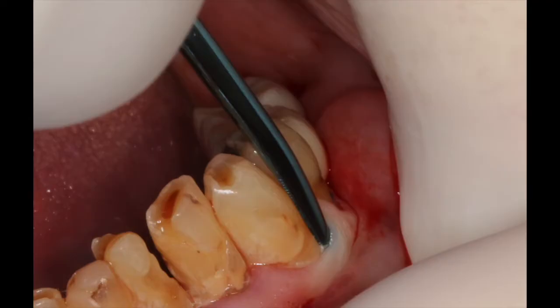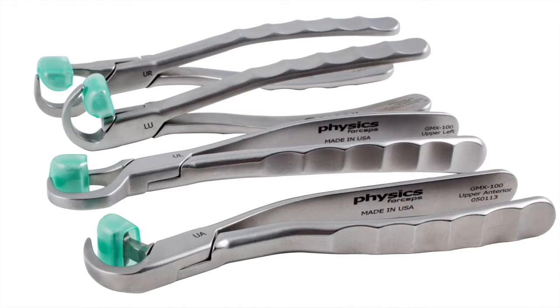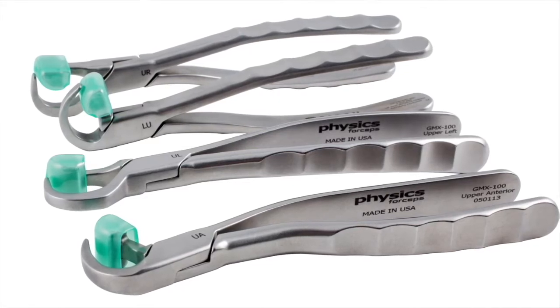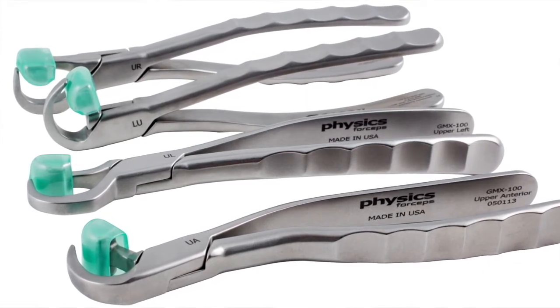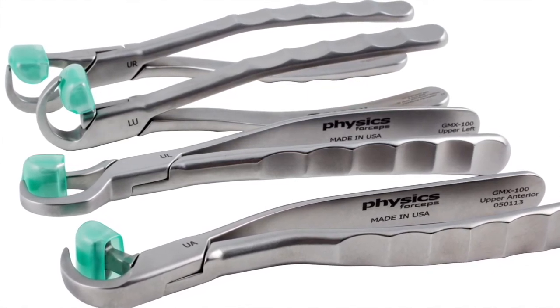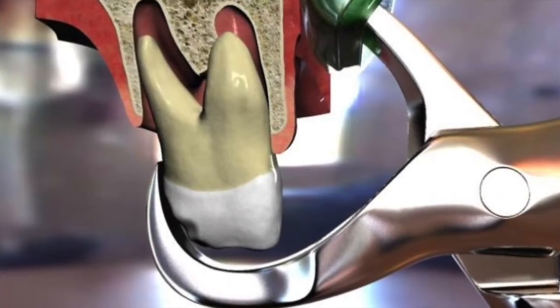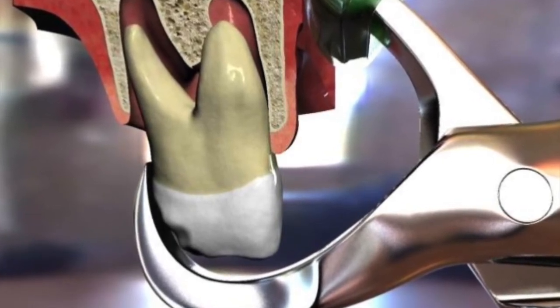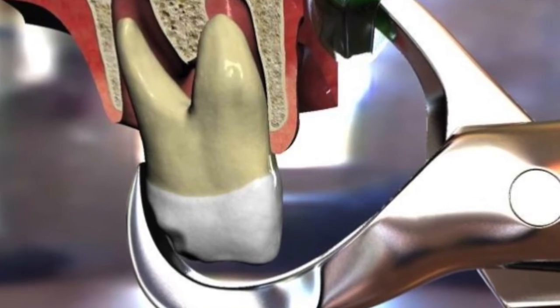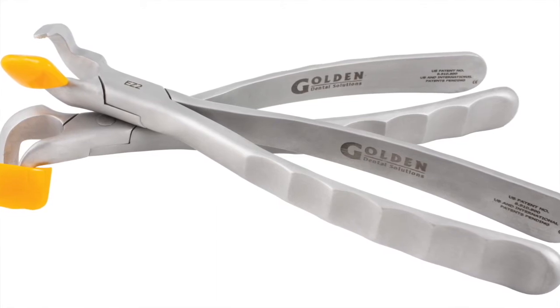Here we're taking a separator, placing it between the facial plate of bone and the root structure to loosen the tooth a little bit. We're then going to use the Golden Dent Physics forceps, which consist of four instruments: an upper left, an upper right, an upper anterior, and a lower universal. It consists of two components — a beak, which is placed subgingival one to three millimeters on the palate or lingual surface, and the bumper, which is simply a center of rotation.